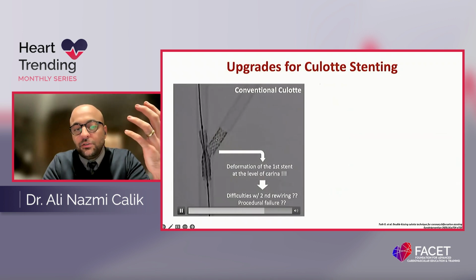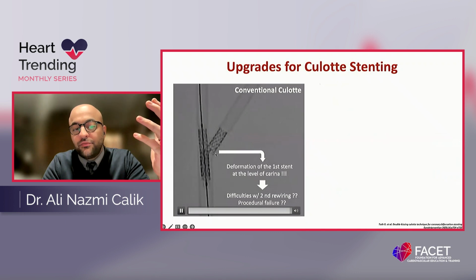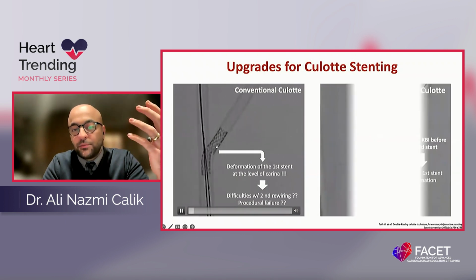As you see, we deployed the first stent going to the right, and without kissing balloon inflation, if you put the second stent, it may deform the first stent. You see, probably this will bring you some difficulties in the second rewiring and the second POT.